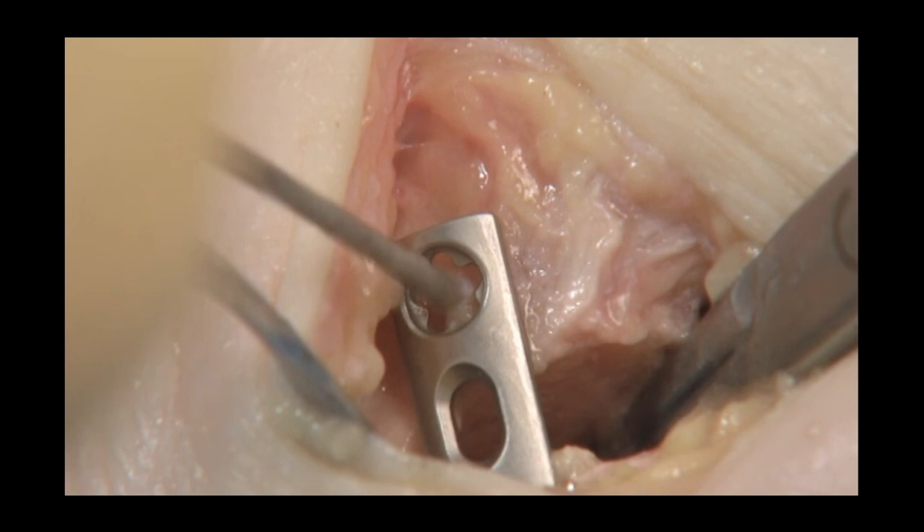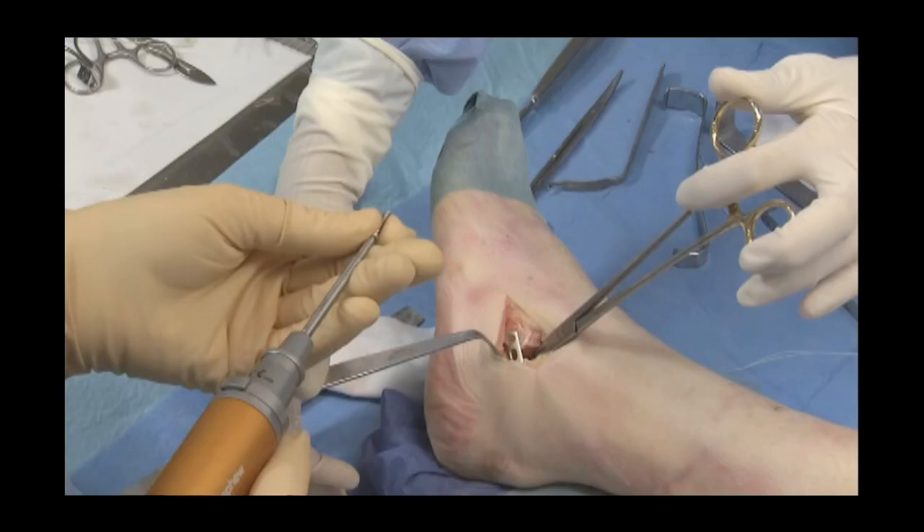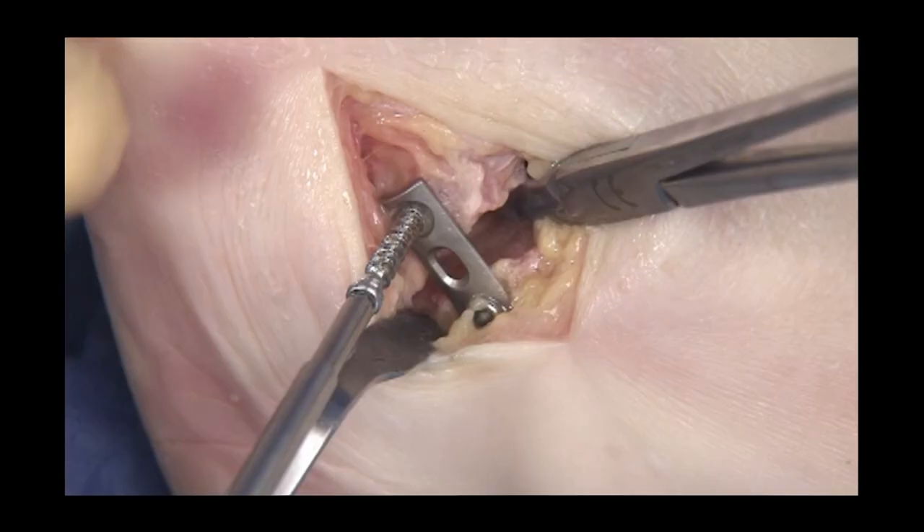4.0 mm locking osteopenia screws can be very useful here. The gap is bone grafted or filled with bone substitute.